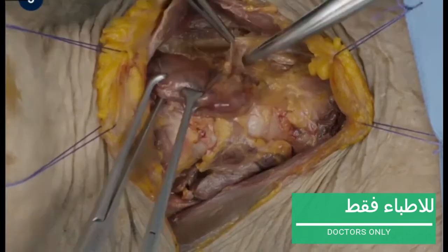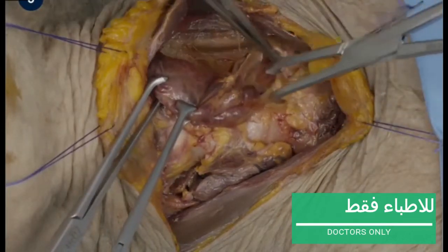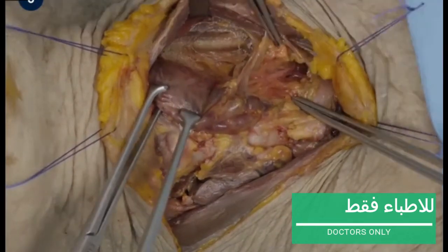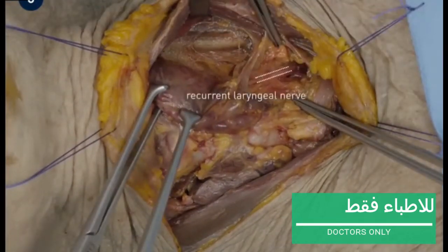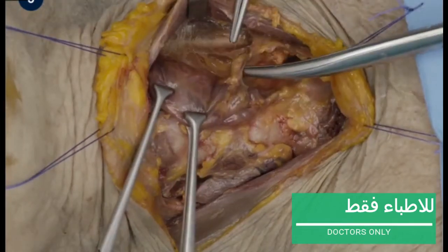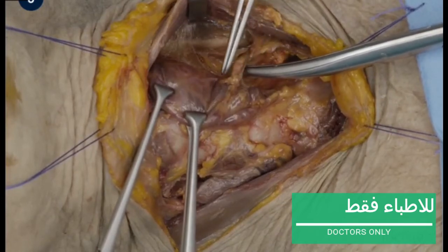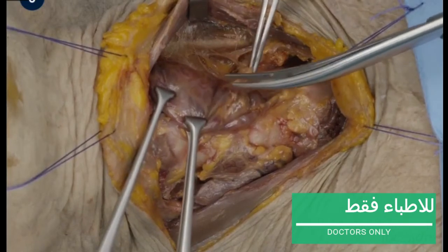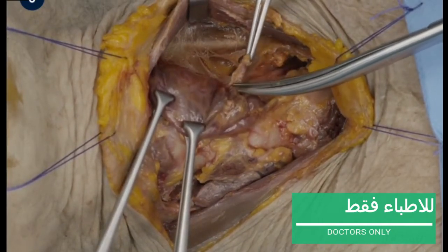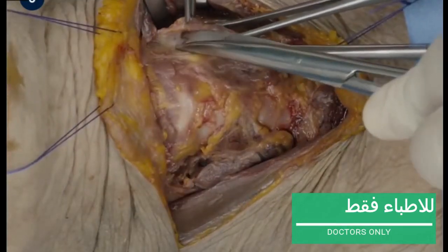To identify the recurrent laryngeal nerve, first the inferior thyroid artery is located. Then the recurrent laryngeal nerve is found. The inferior parathyroid gland is identified and dissected on its medial side to preserve it.